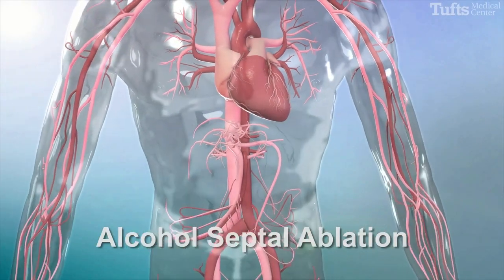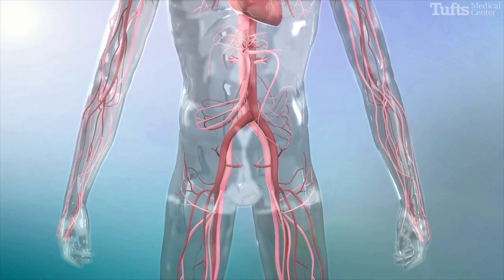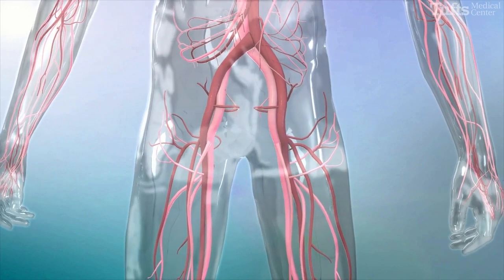Alcohol septal ablation is a minimally invasive catheter-based treatment performed to reduce the thickening of the heart muscle, specifically the ventricular septum.